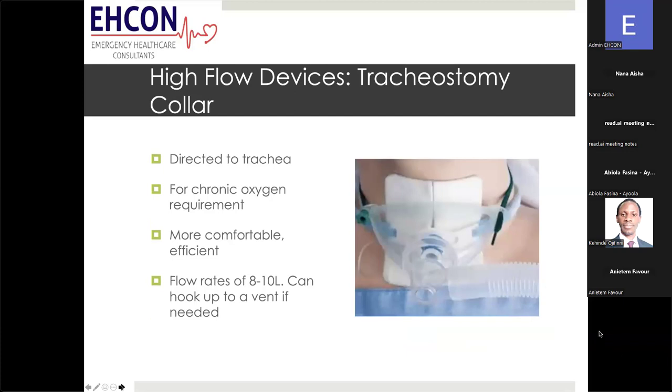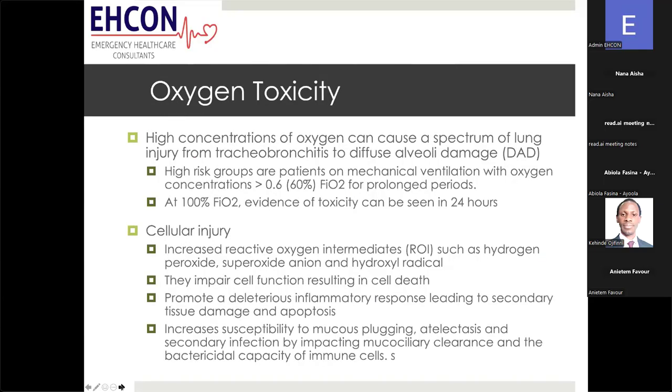And this is a good way to use a weaning protocol before you put on a T-piece. Before you put the person on just a collar, this can actually just be there as well. You don't have to hook it up to anything. For patients who have been weaned to the level where they really need some supplemental oxygen, but you're still watching them to make sure they don't regress back to a need for high supplemental oxygen. So these are some of the ways you can deliver these very directed, very fixed FiO2s per breath for a patient.